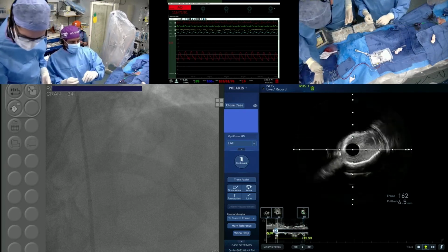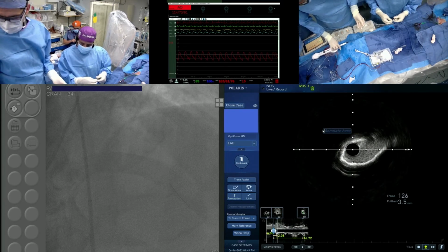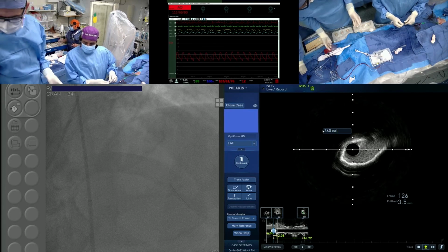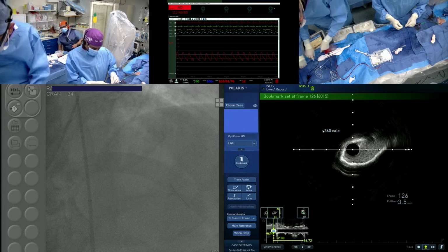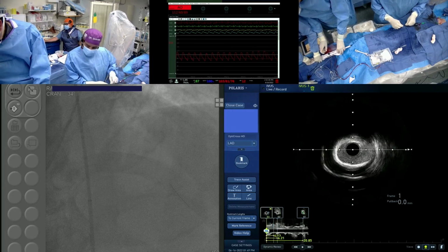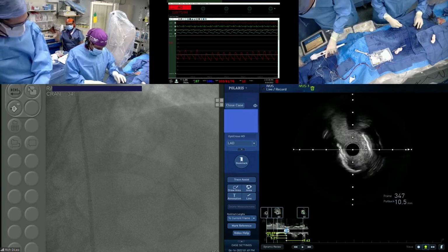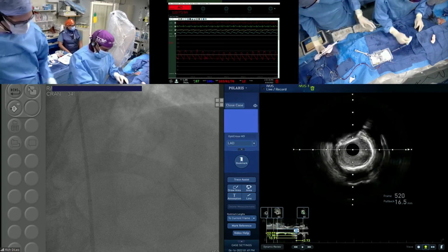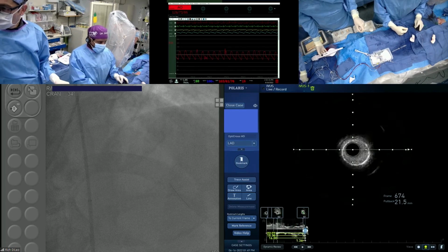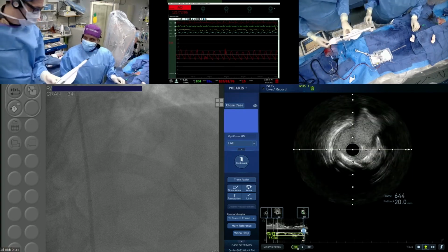Well, George, as you know, that has been the future for the last 20 years. So there is a reason for that. The reason is that I think the concept is attractive, but it's not for every patient, it's not for every surgeon. Would it be for this one? Well, okay, we are testing. I understand you guys are focused on the angiogram. I would like to see the patient around the angiogram. That would give me a lot of information on how easy or difficult the case would be. What is the BSA for this patient?